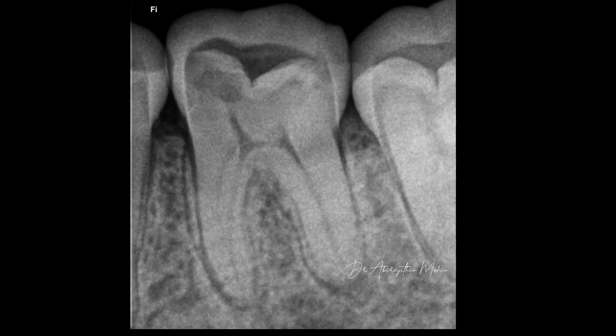Here's the preoperative radiograph of the patient's tooth 36. It's a proximal caries without any occlusal involvement. The treatment plan is to restore the proximal cavity, and occlusally the plan is to be as conservative as possible to preserve the healthy tooth structure.